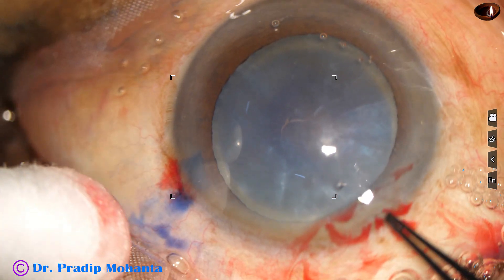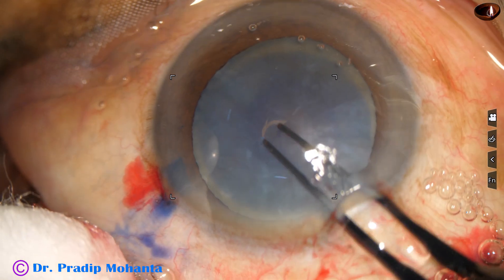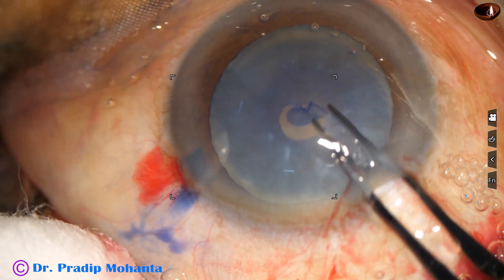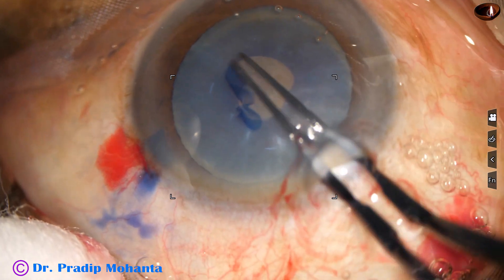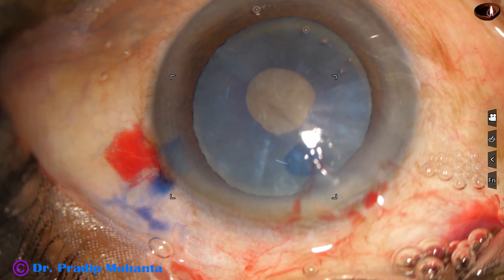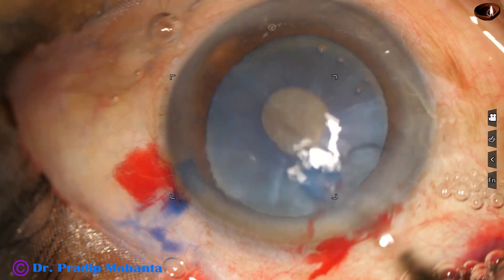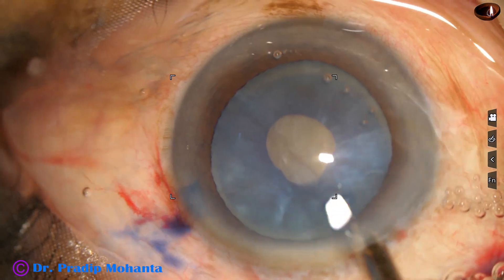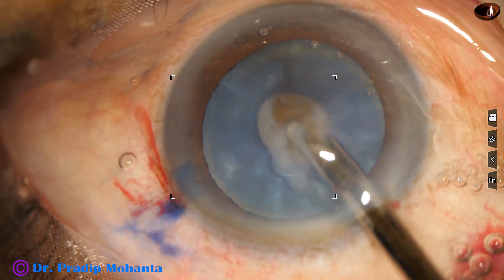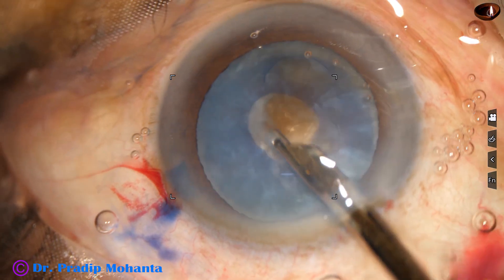You can see some amount of lens matter coming out, so there is some amount of intumescence in this case. It is dangerous to do a large rhexis when the intra-lenticular pressure is on the higher side.